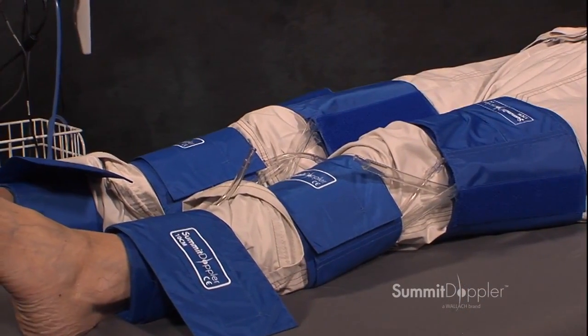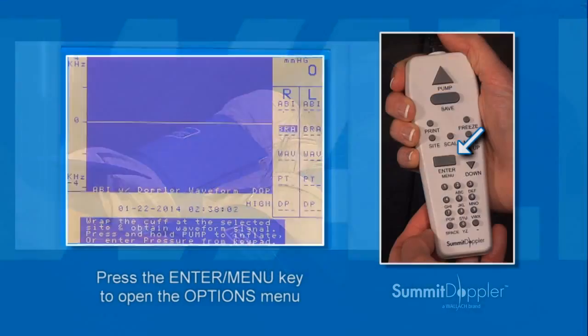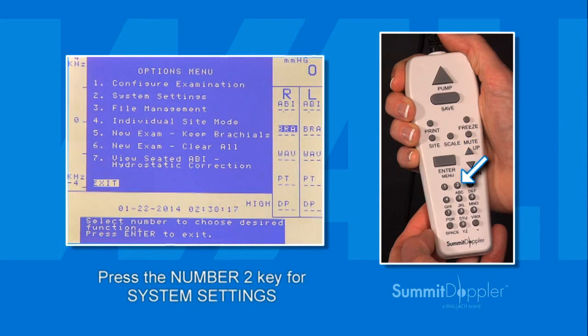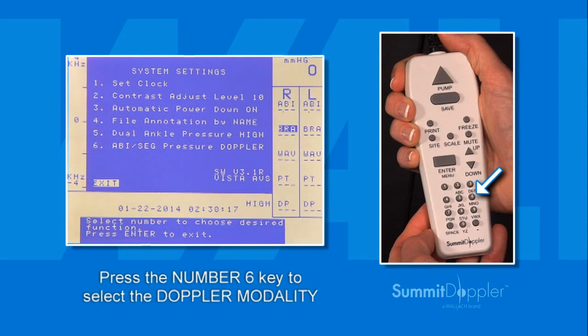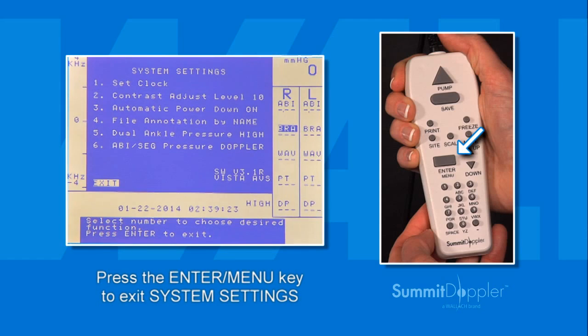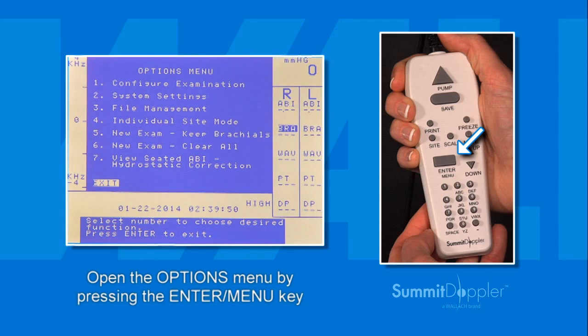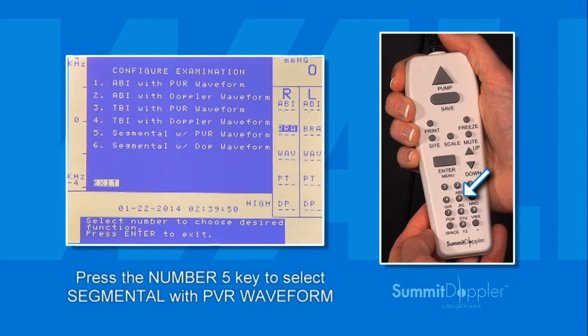Once the cuffs have been wrapped, prepare the unit for a segmental exam with PVR waveforms. Press the Enter menu key to open the Options menu. Next, press the number 2 key on the keypad for System Settings. Then press number 6 to select the Doppler modality, then press the Enter menu key again to exit System Settings. Open the Options menu again, press number 1 for Configure Examination, then press number 5 to select the Segmental with PVR waveform option.